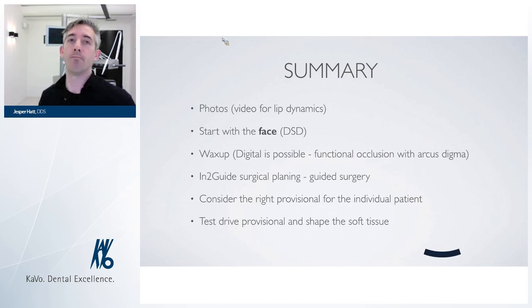Does it take longer? Yes. Is it more difficult to work with? Not really, but it takes a lot more time. That makes the final treatment a little bit more expensive for the patient. But I get to sleep a lot more relaxed every night because I know that my provisionals have held up and there are no problems in the provisionals. I would much rather see the failures on the provisional than on the final result. And of course, we use the provisionals to shape the soft tissue to get a perfect emergent profile, or at least as perfect as it's possible to get.